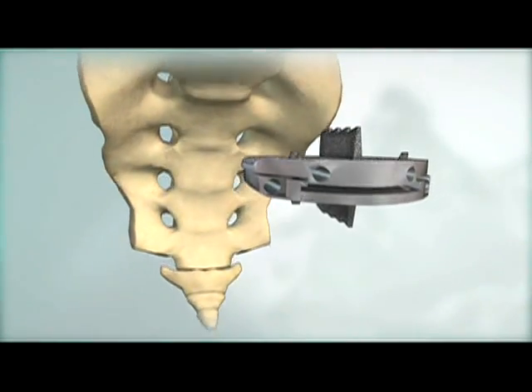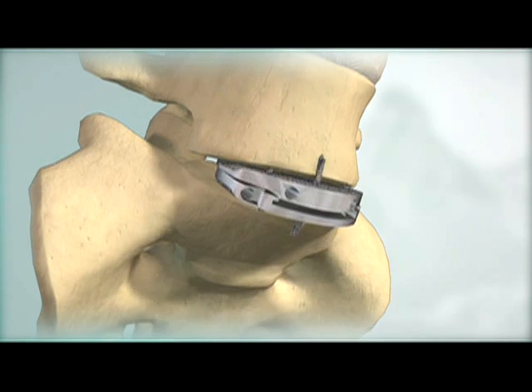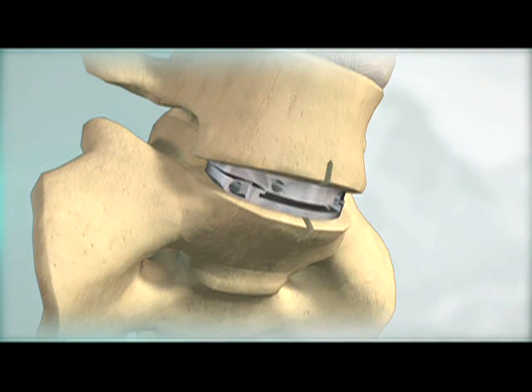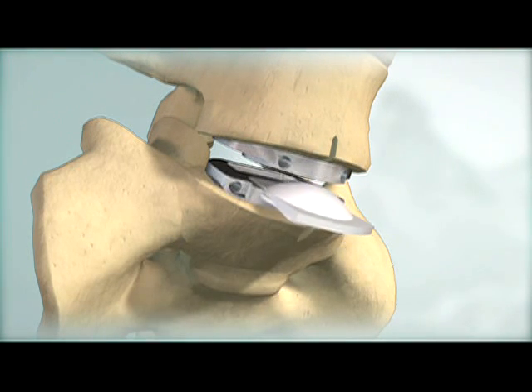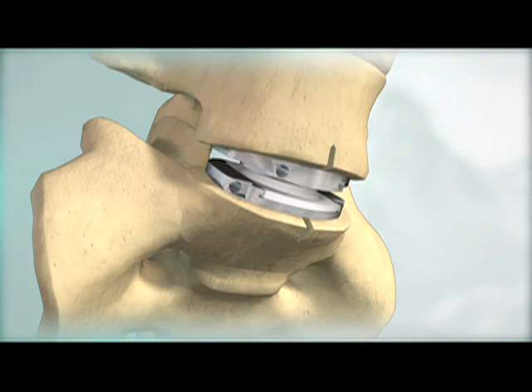The ProDisc-L End Plates are inserted in a collapsed position and then distracted for the polyethylene inlay insertion. This modular technique facilitates end plate insertion and provides controlled distraction for polyethylene inlay assembly.